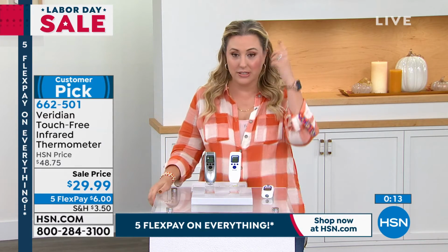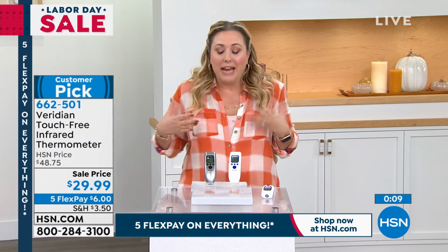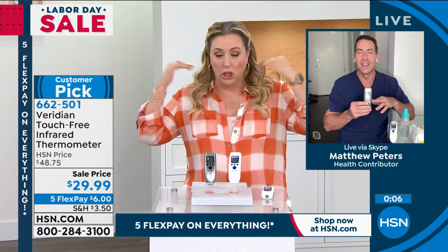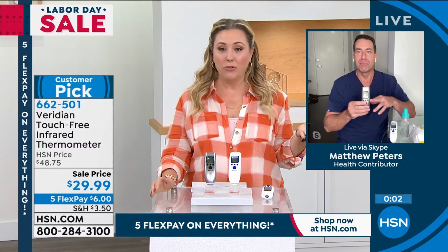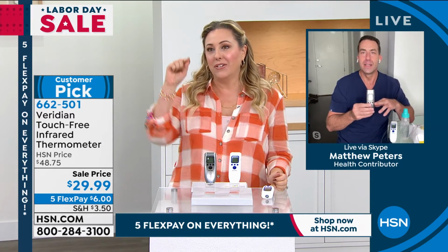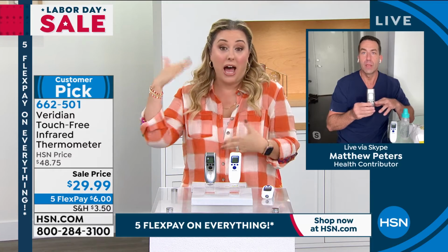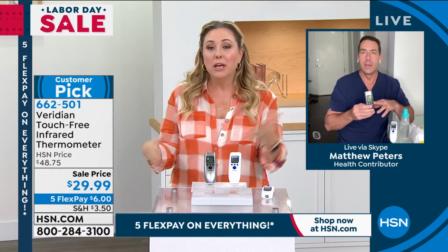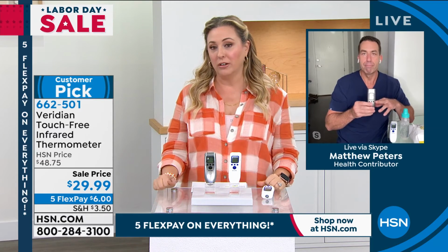And by the way, I just took my temperatures and you saw it. The other thing I like to know, Matt, is that my regular temperature is a little bit lower. Not everybody is like 98.6. Mine is always below that. So if I have a fever, if mine is like 97, 98, 99, to me, that's 2 degrees, like that's a higher fever than it would be for most people, because I know my regular temperature is a little bit lower than what most people are.